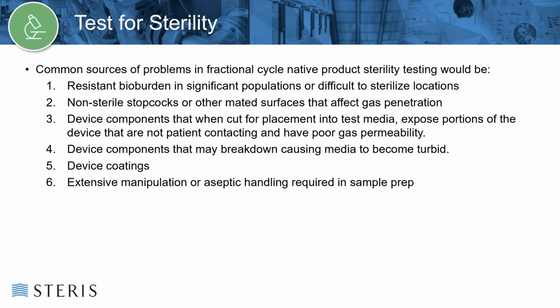The test of sterility is detailed in ISO 11737-2. Additionally, USP 71 might be referenced. For products from animal source materials or packaged in a manner that removes oxygen, additional media types may be necessary to ensure recovery of organisms that grow in the absence of oxygen.